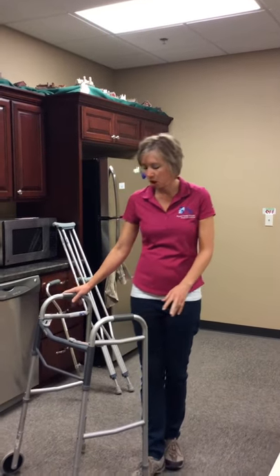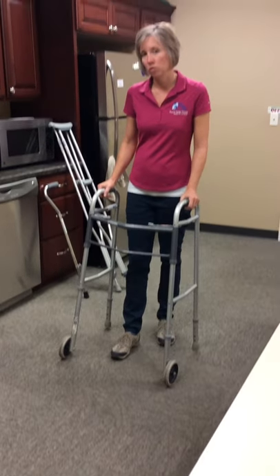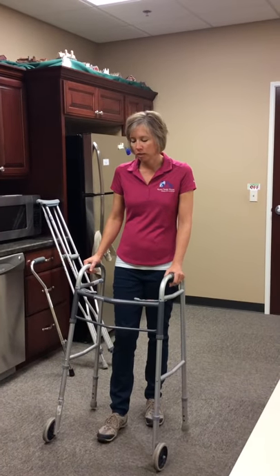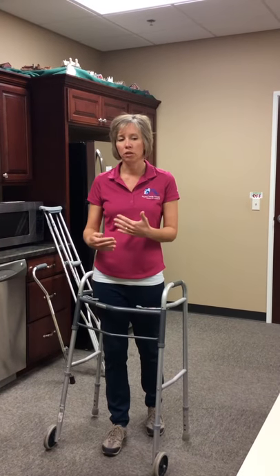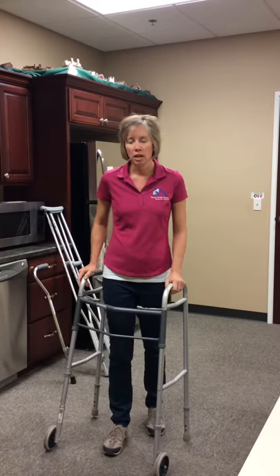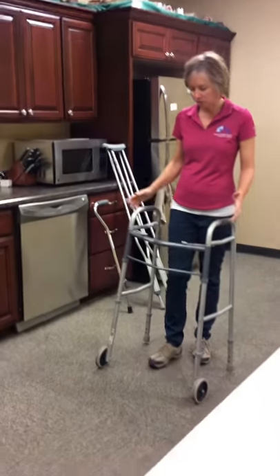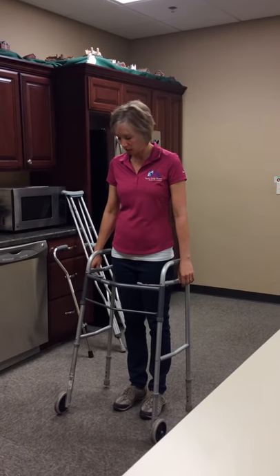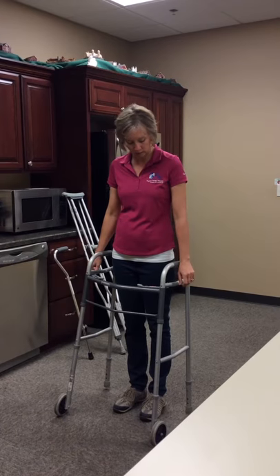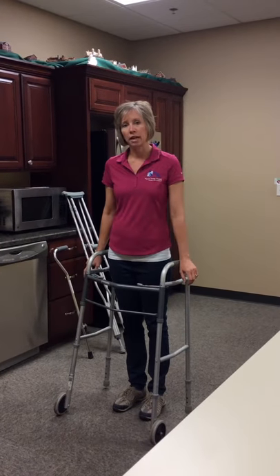First of all, we have a walker here. Front-wheeled walkers are probably the most common, and we like them a lot because they can help you maintain a normal walking pattern. With the front-wheeled walker, you want to stand inside the walker and let your hands hang down by the hand rest. If the rest comes up to your wrists, you know you have the right height.